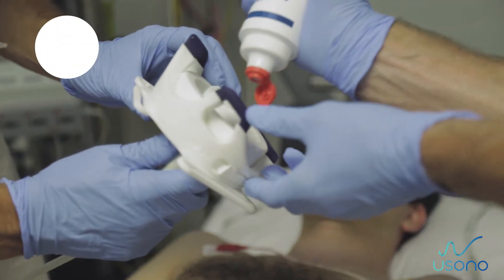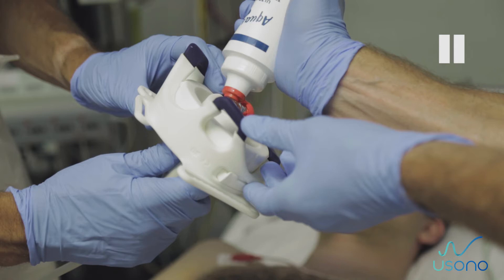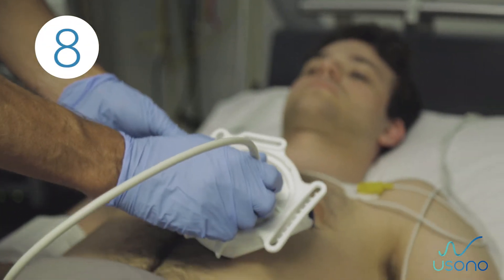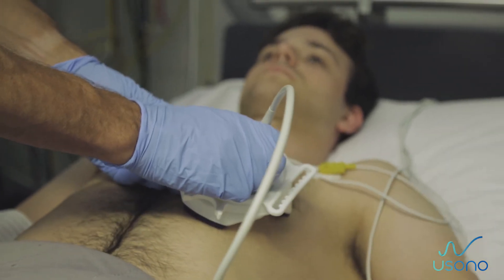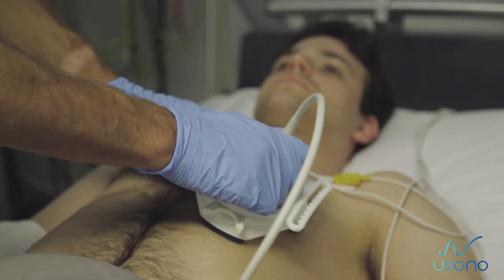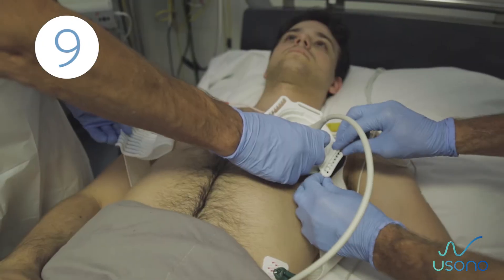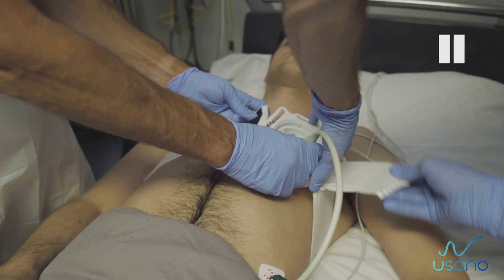Step 7: Apply enough gel to cover the probe. Step 8: Move the probe and the probe fix together to determine the correct position for scanning. Ensure that the probe fix is facing the right direction as described in the illustration.